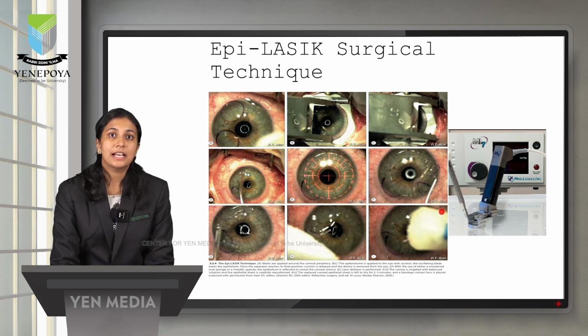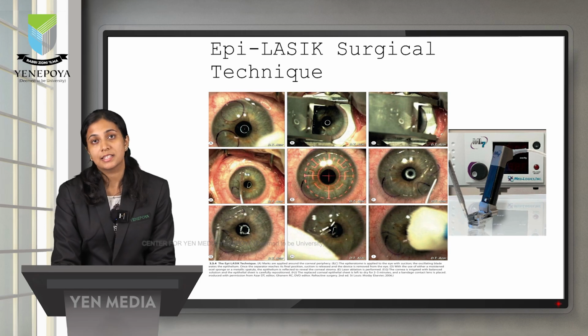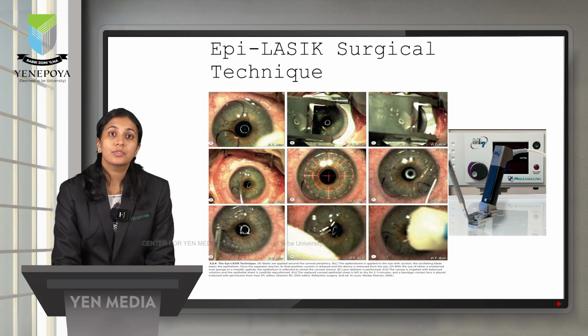Now the steps in epi-LASIK and LASIK are almost the same, but the difference is that in epi-LASIK you separate the epithelium using an instrument called an epikeratome, while in LASIK you use an instrument called the microkeratome.